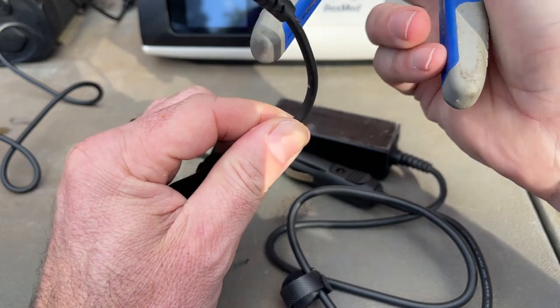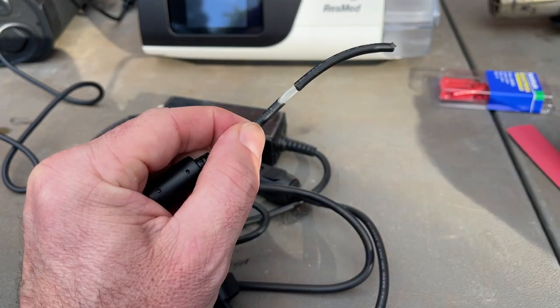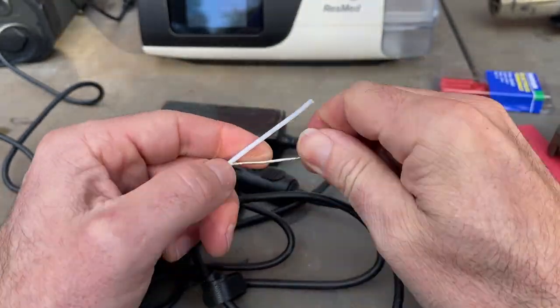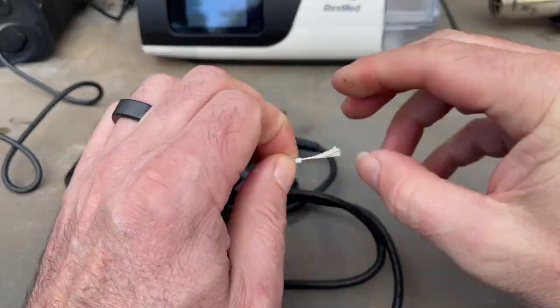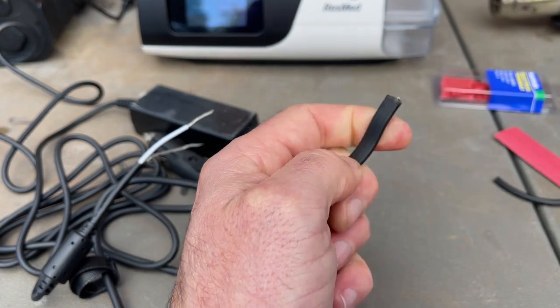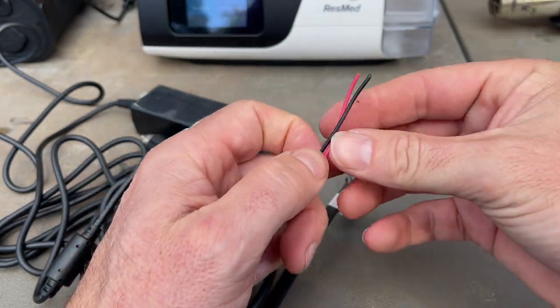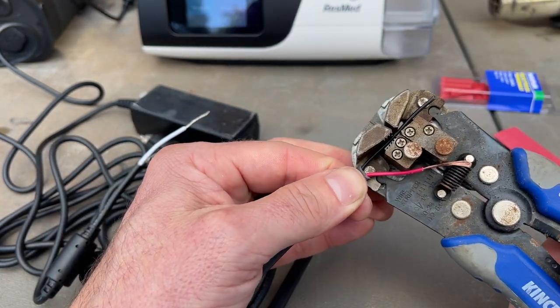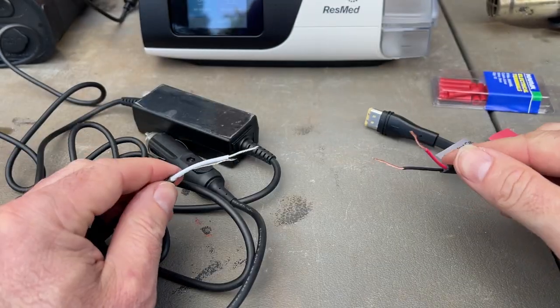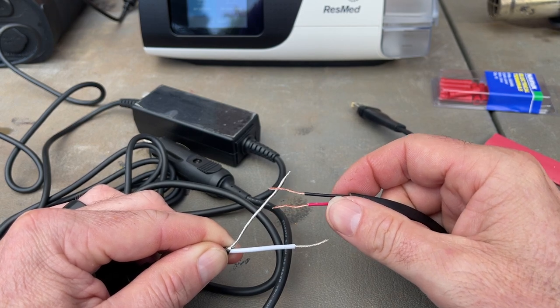Let's cut off the tip. Let's expose the wires. Now we'll do the same over here. So now we've just got to join up the red to the white — positive to positive — and the black to the unshielded one. That's negative to negative.